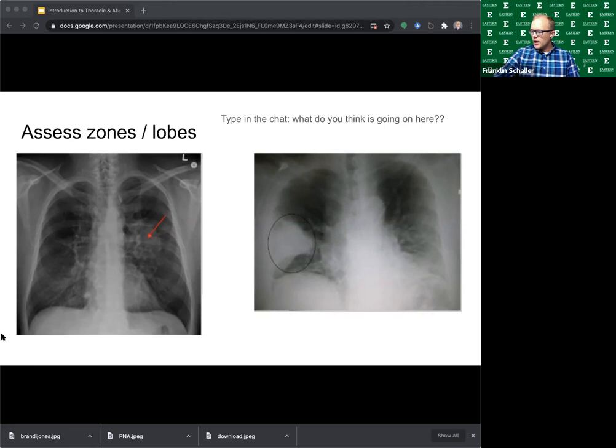And our image on the right is a pneumonia in that right middle, right lower lobe. And it's pretty obvious, it's pretty white. That's an obvious right middle lobe, right lower lobe opacity. So here, just giving you guys a couple chest x-ray examples of different pathologies that you might see on your chest x-ray.